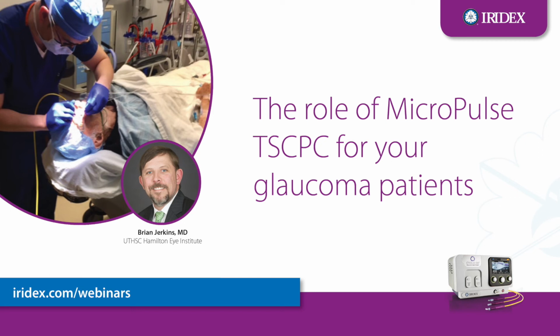Okay. Do you take pigmentation into consideration as you're treating your patients? I know that from a continuous wave treatment, there is a technique Dr. Gasterlin had basically spearheaded where they do look at iris color and they do try to equate that to pigmentation and make changes based on that in terms of power and duration. Do you take that into consideration with MicroPulse? I do a little bit of decreasing the duration. I think I've decreased it on a few people that I was worried about that, but I have not been playing around with the power.